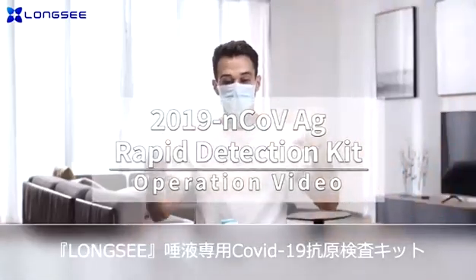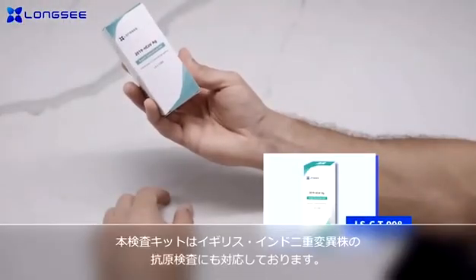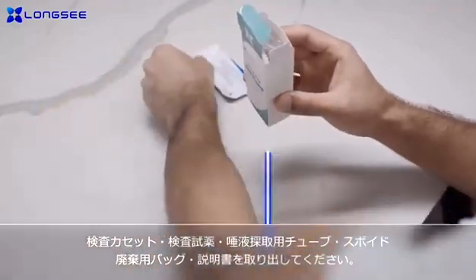Longsea 2019 NCOV-AG Rapid Detection Kit for use at home enables you to take a rapid 2019 NCOV test. Before the test, read the instructions and follow the steps.